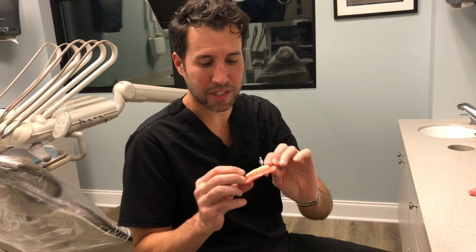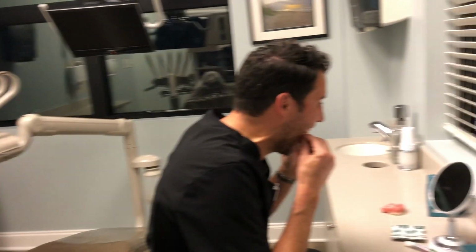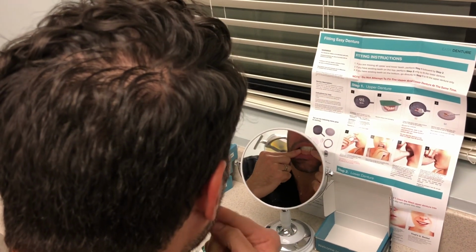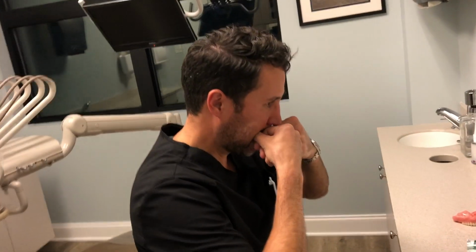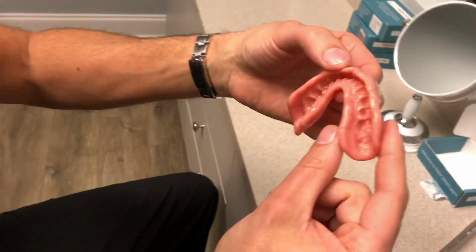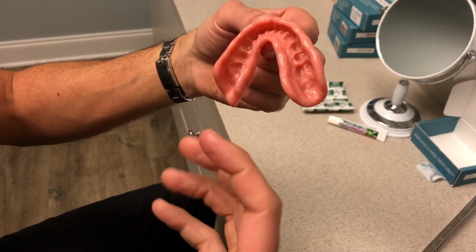It's been 60 seconds now since the lower Easy Denture has been out. I'll go ahead and put it in and adapt it to, remember, it's going over my teeth. I have teeth, so it's not going to be a complete fit, but occlusion's good. I'm down to my canine. You see how my canine comes down there and how it adapted nicely to that area. And let's see the inside. See how it fully adapted over my teeth. So that's going to be plenty of length for you to capture a complete vestibule.